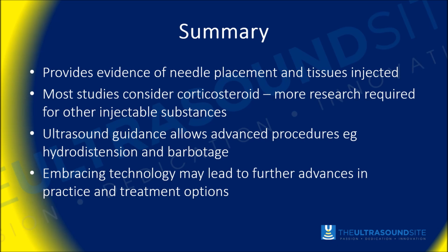Ultrasound guidance allows advanced practice procedures, hydrodistension, barbotage, and also we know that it allows the use of these other treatment techniques and developing techniques. Embracing technology may lead to further advantages in practice and treatment options.